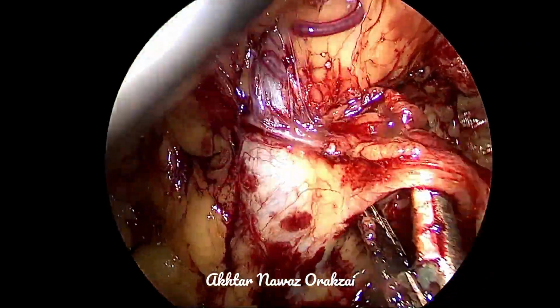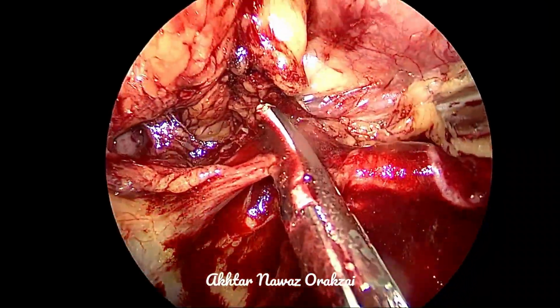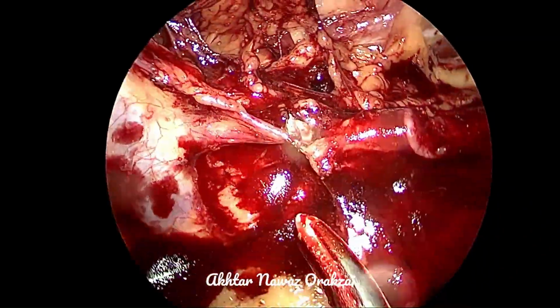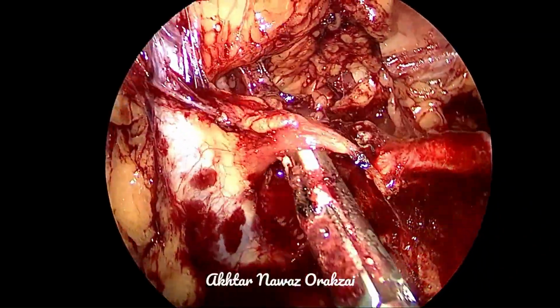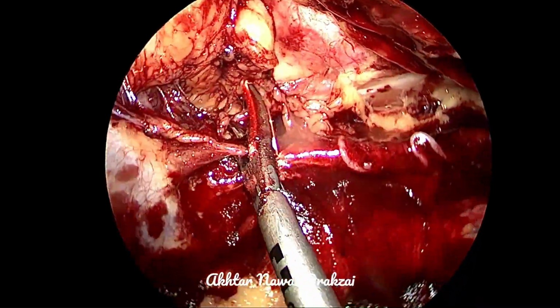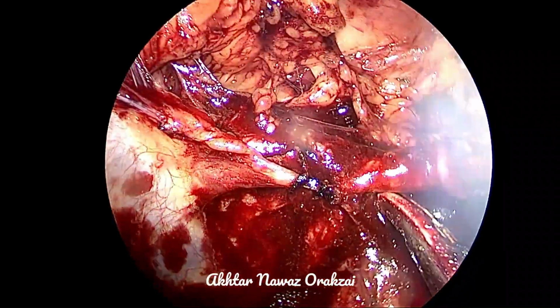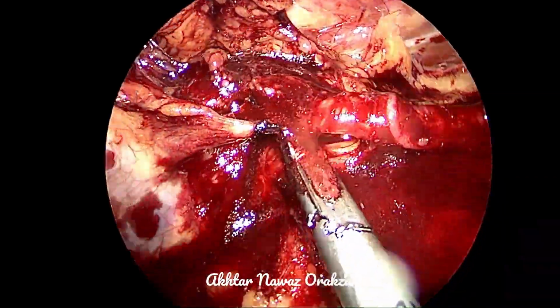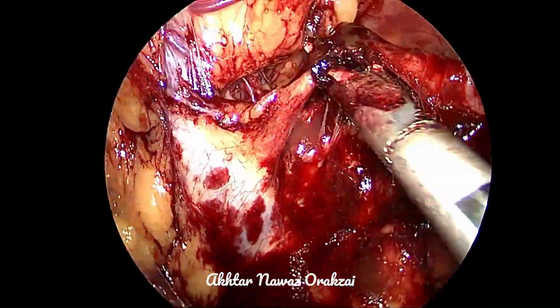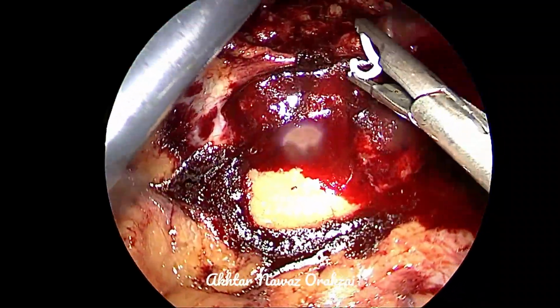We have already dissected the colon, mobilized the colon, identified the ureter, and mobilized the lower pole as well. So we were moving swiftly towards the hilum, but here we found that there was another vein going towards the kidney. So we decided to mobilize and cut the gonadal vein so that we can have an easy access on the aorta and the pedicle.